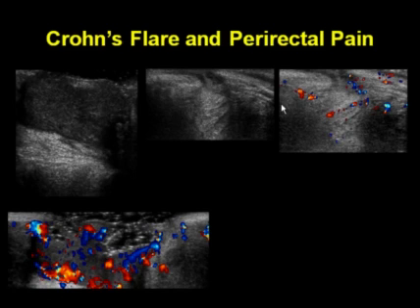Here's a patient with known Crohn's disease who developed a flare and complained of severe perirectal pain. You can see in these sonograms, which were performed with the patient prone, so this is the skin surface, there's gel, we see very prominent inflammatory tissue immediately below the surface of the skin, extremely hyperemic with color Doppler, and actually a fistula can be identified as well, extending to the skin with flow through this fistula seen in real time.